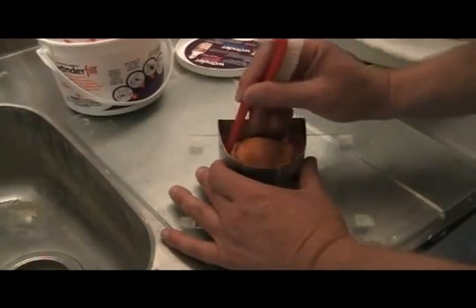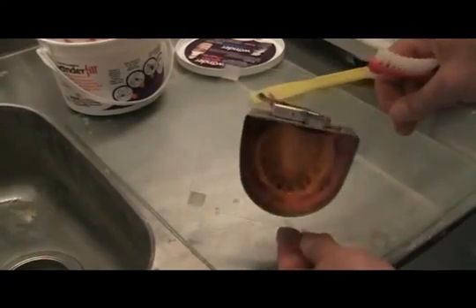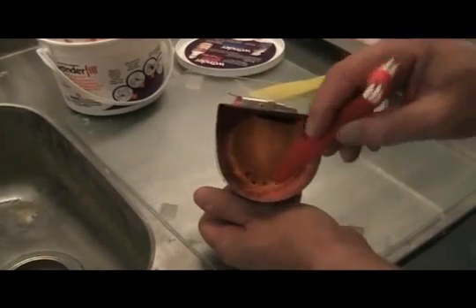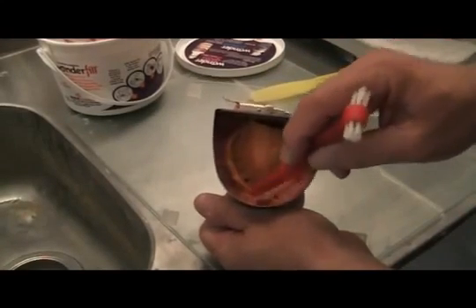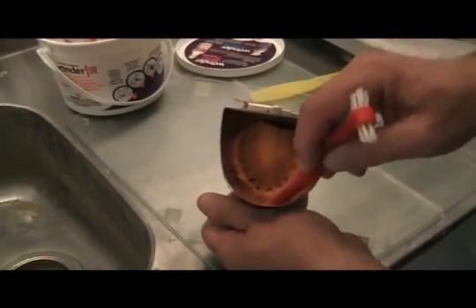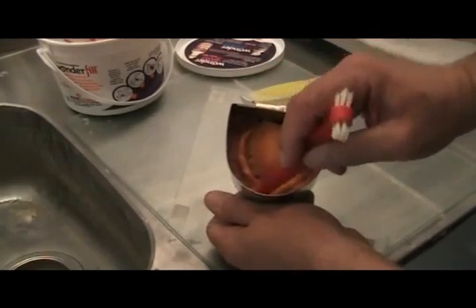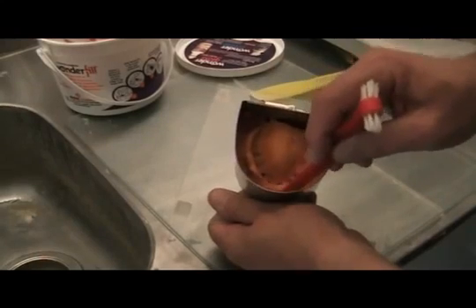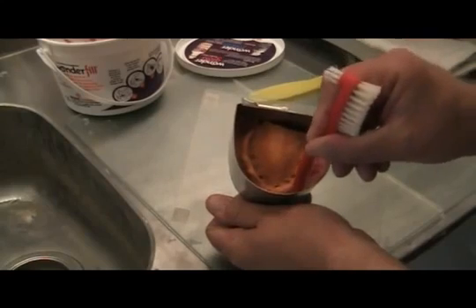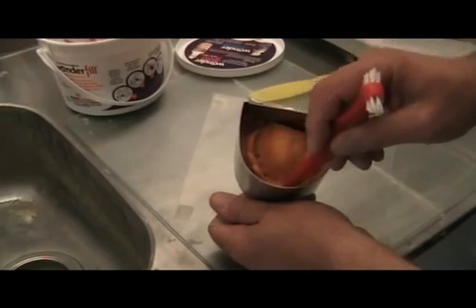And again, I'm just working it around the perimeter. I'll see if I can hold it on edge and do it just to show you. But literally, I'm just pushing the material down. The material will push down to the bottom a bit, but what I'm doing is I'm clearing that area, around that line that I drew to capture the sulcus, the width of the sulcus, to create a land area, and take the place of all that crazy waxing that we used to do for the same kind of boxing.